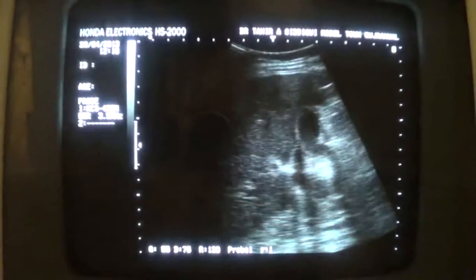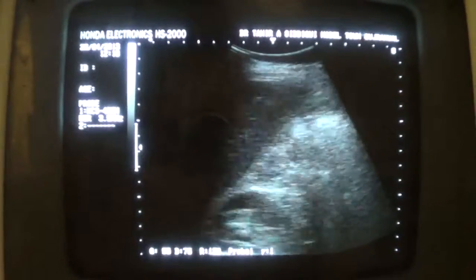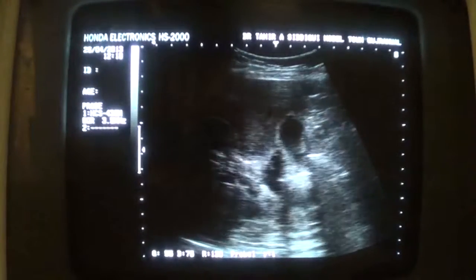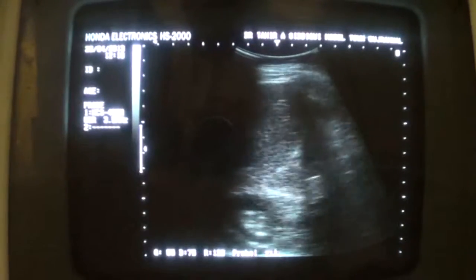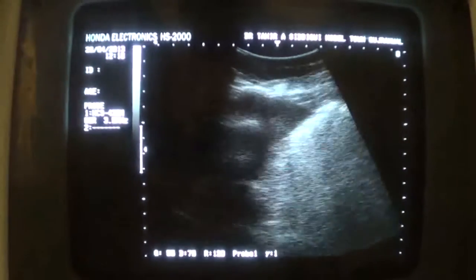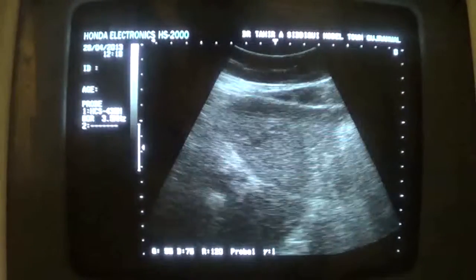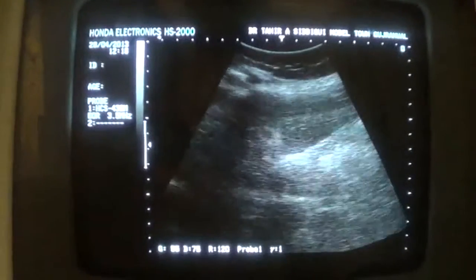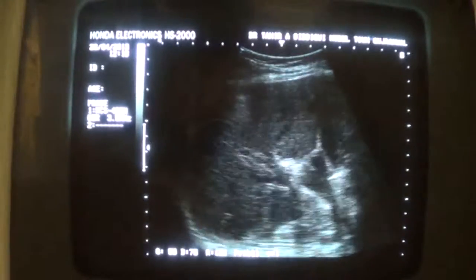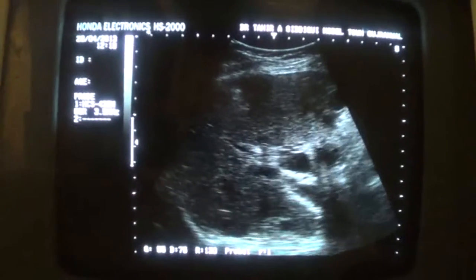This is the gallbladder fold. Now here we see the dilated intrahepatic bile ducts. This is the left lobe of the liver. This is the region of the porta hepatis.